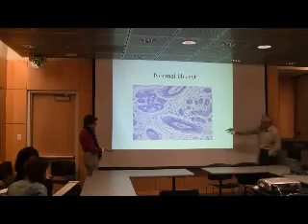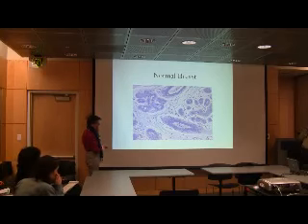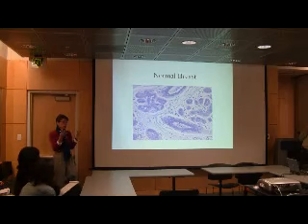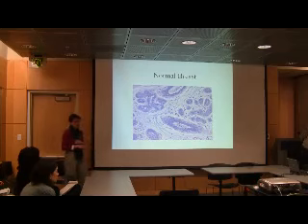And down here you can actually see a couple of small vessels. A little vessel, and they each have a little bit of blood in them. When you cut the tissue, the blood vessels drain out because they're open tubes. So often you don't see a whole lot. In life, this will be totally packed with red cells.